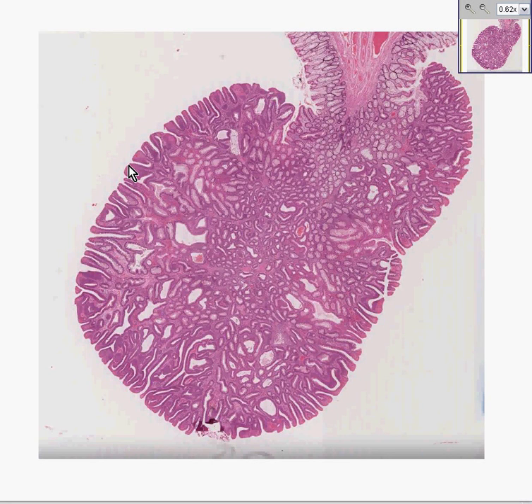Here is another polyp of the colon. You could notice that instantly. Notice that in the stalk of the colon, you could see that it is cuffed by a normal type of colonic mucosa on this side and on this side.